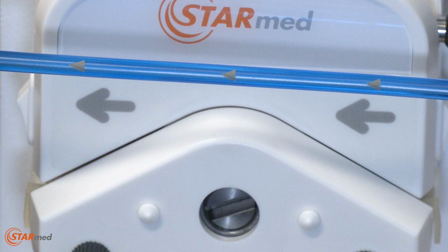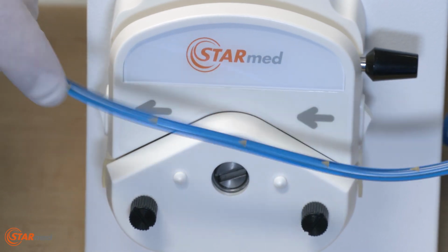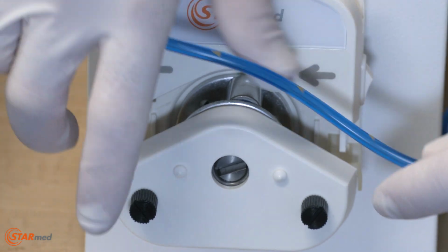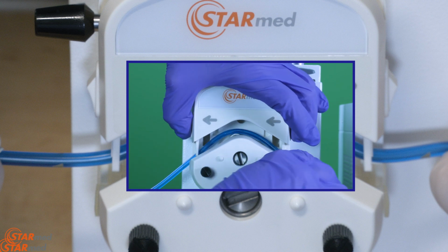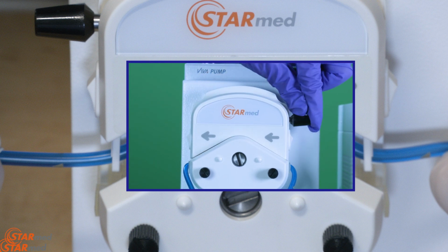The tube's arrows should face the same direction as that of the pump's flow. Use the lever to open the pump's head, then place the blue inflow tubing inside the pump's roller. While making sure that the tubing is in the center of the roller, stretch both ends of the tubing and then close the pump's head by using the lever.